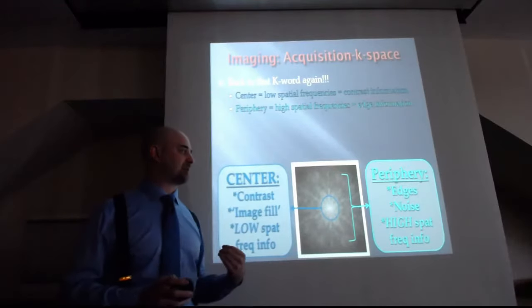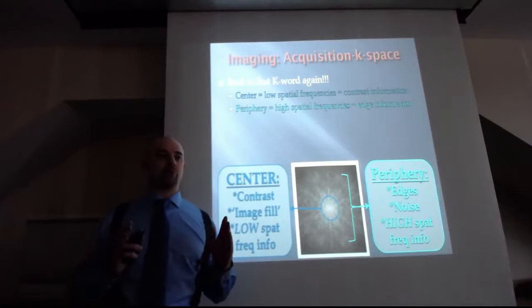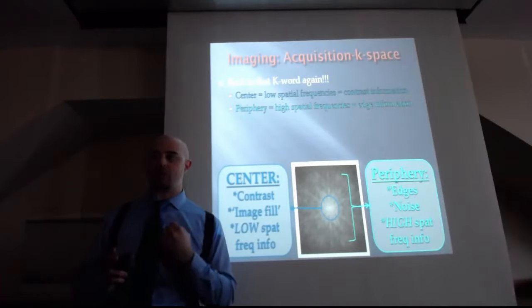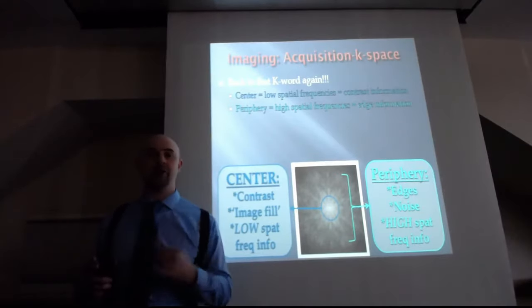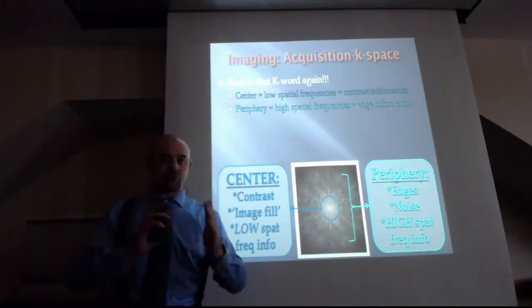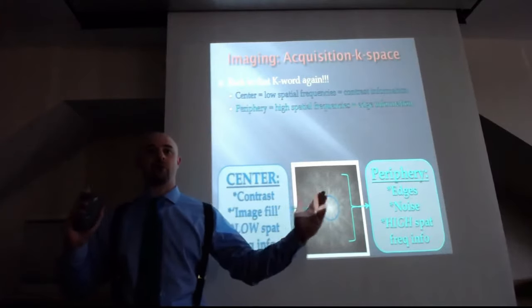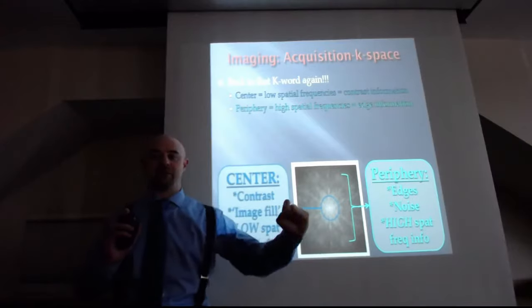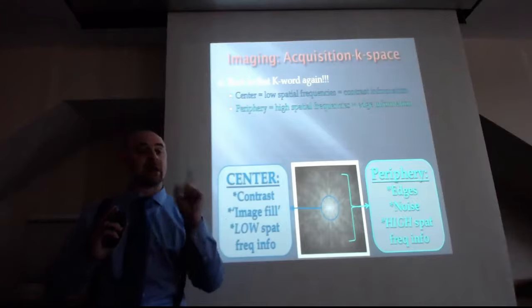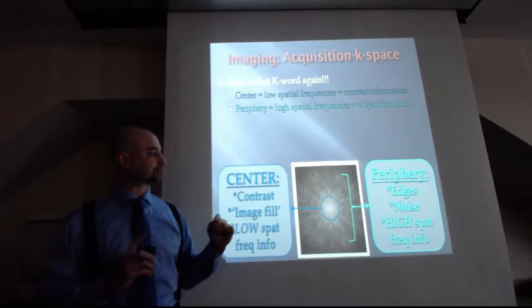Noise is a high spatial frequency feature, right? Think about it. Every individual pixel we have has noise in it, because you get noise with every independent measurement, and noise is statistically independent. So if I were to try and image, say, a gray flat field that should just be all one value of gray, well, every pixel in that field is going to be a little off by some number, which is noise, and that noise should not be correlated, oversimplified, with other pixels, right?